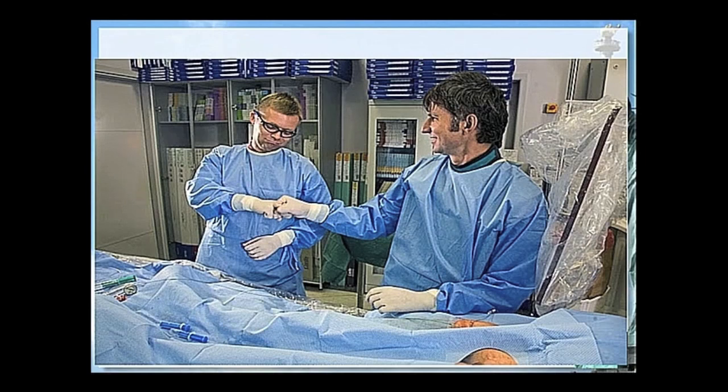In our hospital, these procedures are performed by vascular surgeons. So for us, there's no problem, but it's a complication. Sometimes after balloon rupture, it's virtually impossible to remove this equipment, and you have to open the femoral vein. Fortunately, the patients are in proper hands, so it's not a big problem for us. Anyway, it's a complication.